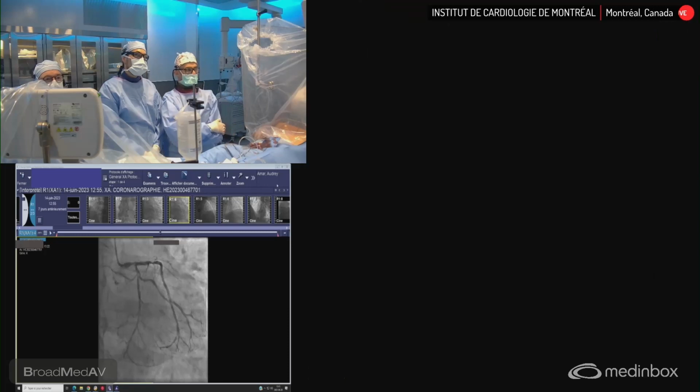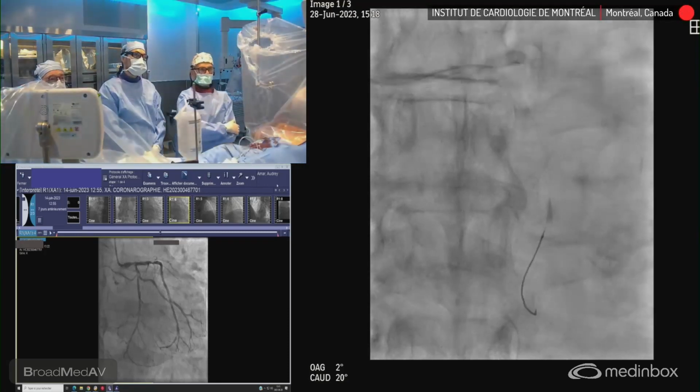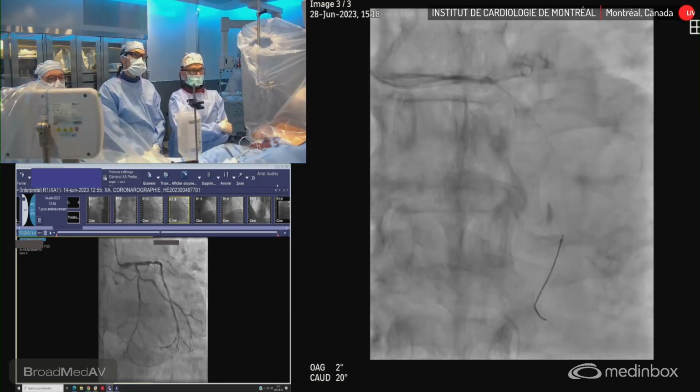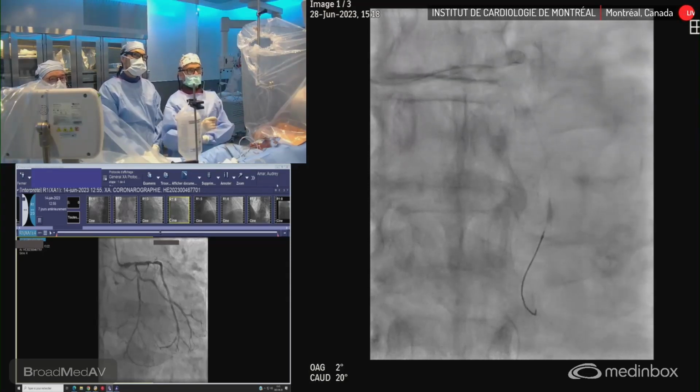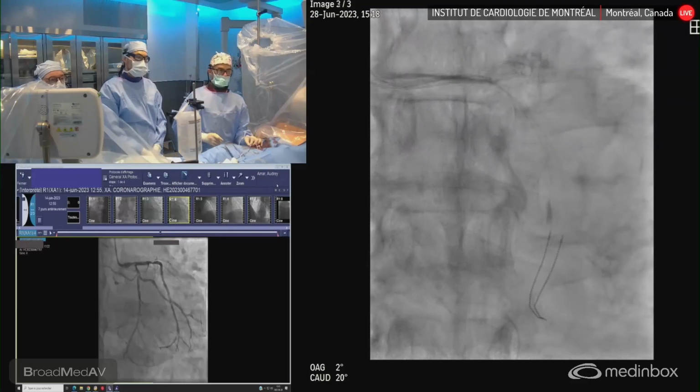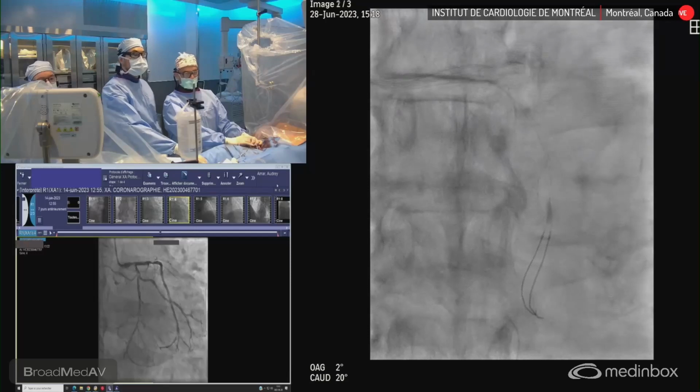We can see superficial calcium and also deep calcium. And here you see quite a large amount of calcium. That's in the left main now. Yeah, it's the distal left main to ostial circumflex. You see that it's a wide, large left main. We can discuss that. So it's a 5.0 millimeter left main. And I've seen two things.